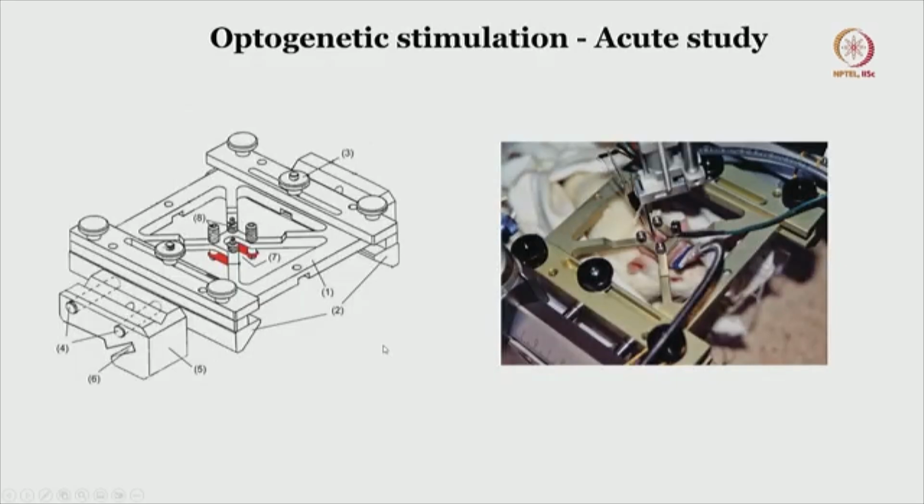So another important additional apparatus that can be used along with the stereotactic frame is this rigid cranial fixation.